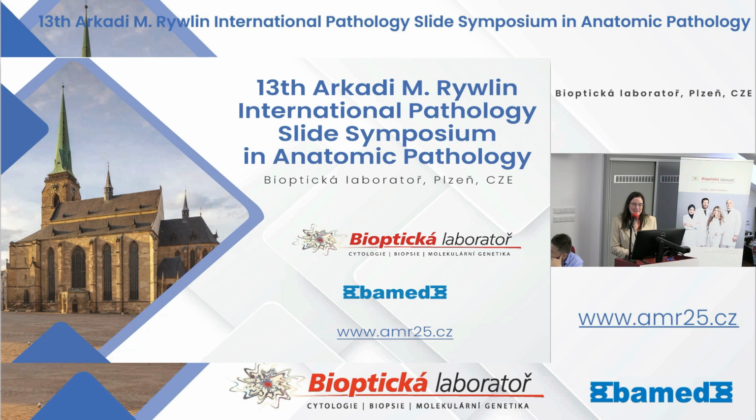It's hard to say what's driving this. Again, probably some stem cell that has dual differentiation. And then the metastases, I don't know offhand. In the example that I showed with metastases, it seemed mostly like the spindle cell component was there, but I'm not 100% sure on that.